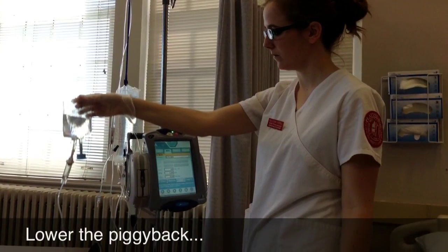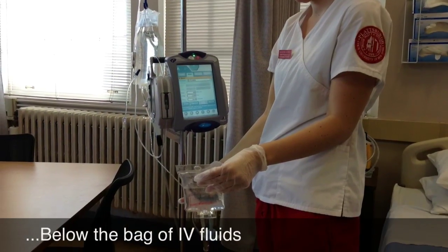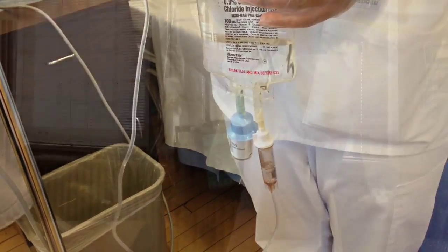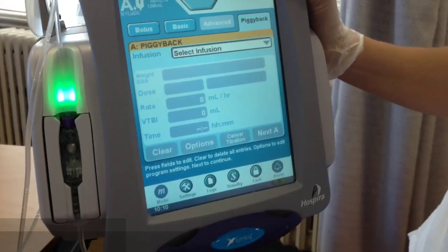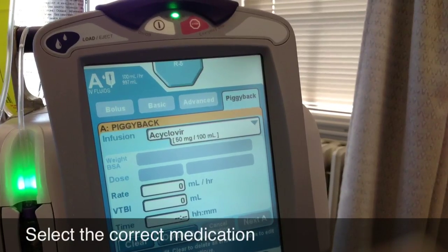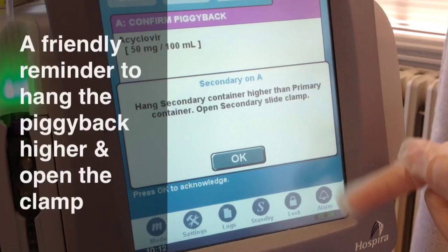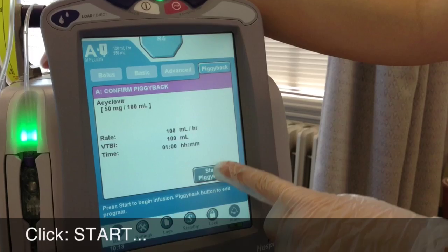Back priming is very simple and actually pretty cool. First, lower the piggyback below the level of the primary bag of IV fluids and the pump. Then unclamp the secondary line and watch as the fluids from the first bag back up into the secondary tubing. Now you're ready to program the pump — select piggyback from the menu, then select the correct medication to be infused. Enter your rate, volume, and time as ordered. It'll remind you to hang the piggyback higher and to open the clamp, then just click start infusion.